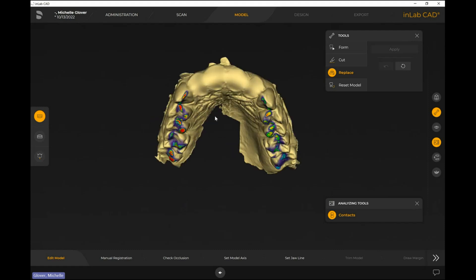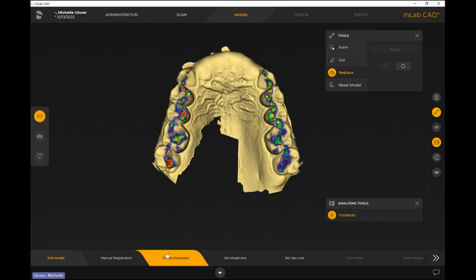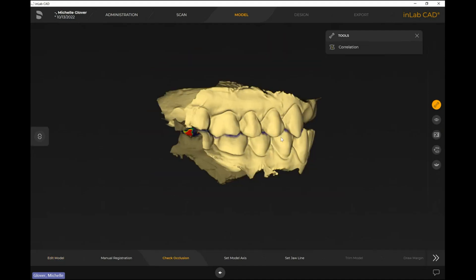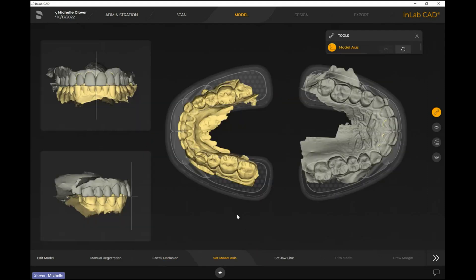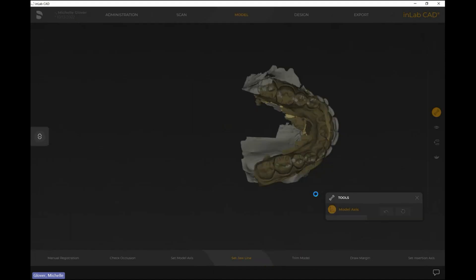From here the steps along the bottom are all still the same — I don't really need to do anything with check occlusion, it's just showing the patient's bite scan. Now with set model axis, because we did a duplicate copy, I can see where the midline is, where the canine is, the occlusal plane — and I line this up like I normally would. Having the biocopy helps justify where the teeth are lined up.